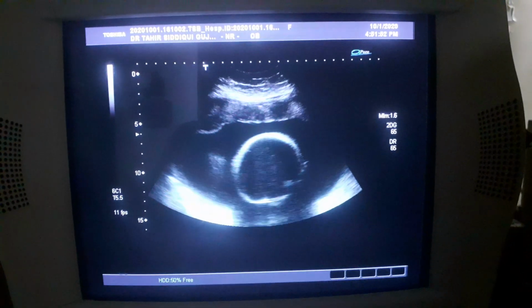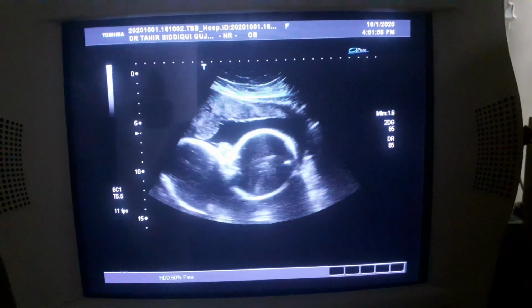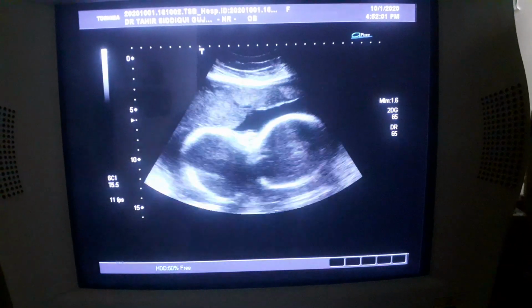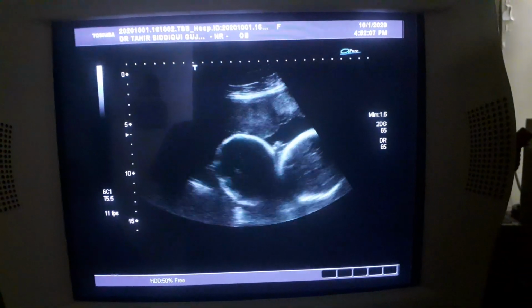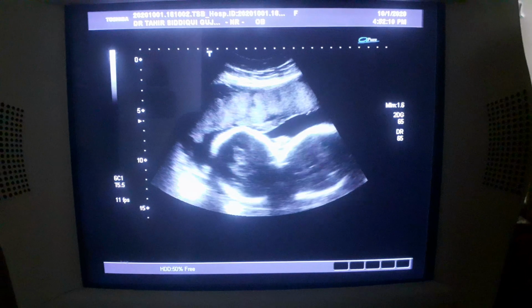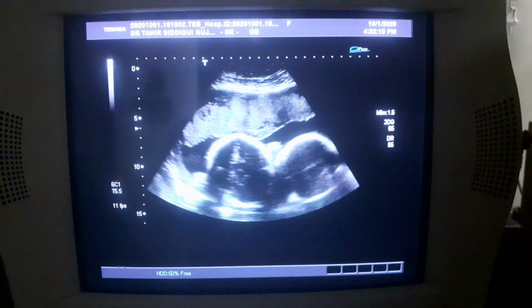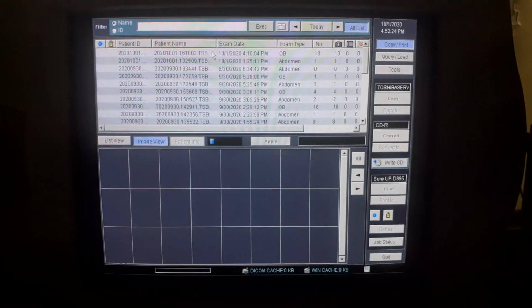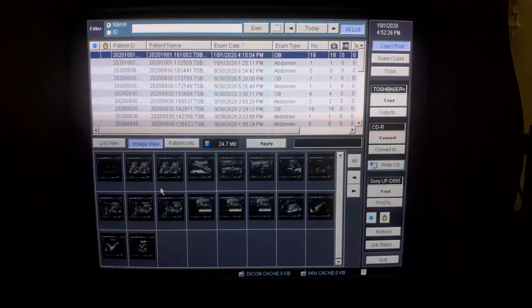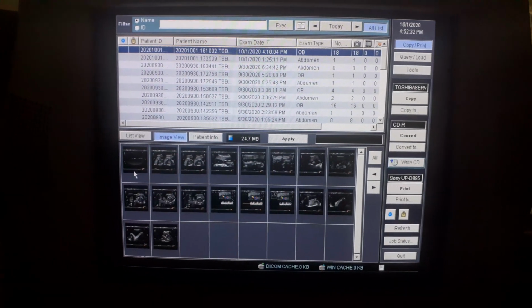Now, if I try to show you the measurements that I have taken, for your convenience, and mine too. Now let me show you from the images I have stored. The measurements. Any measurements that are important?